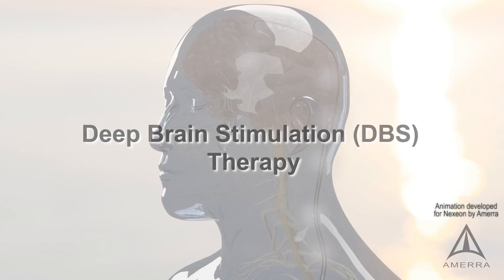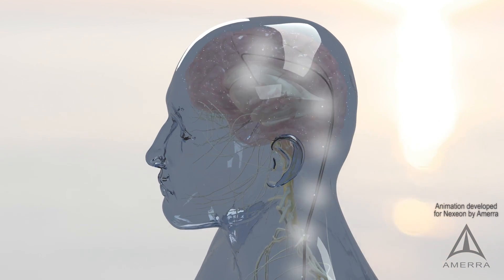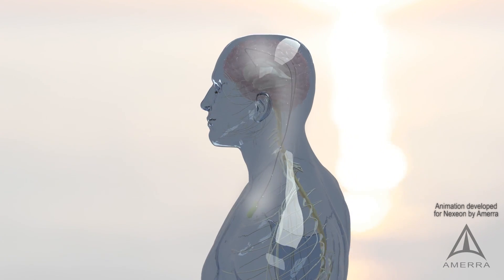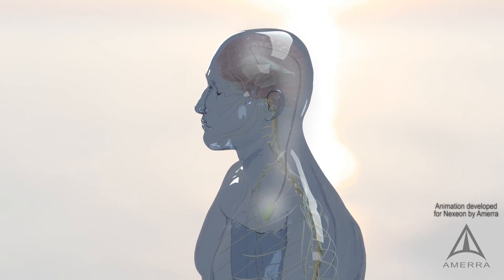DBS therapy utilizes a small device similar to a pacemaker with two thin wires called leads, which are implanted within the brain and are used to block messages that cause symptoms associated with Parkinson's.